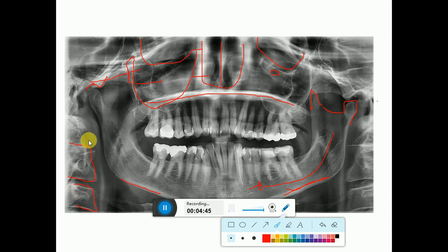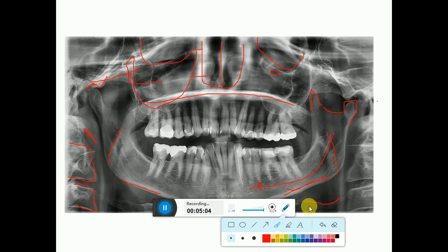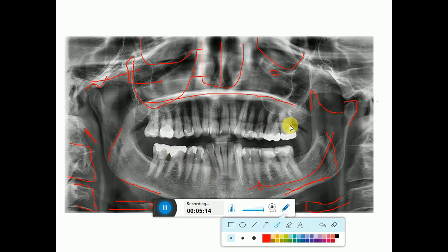This is the zygomatic arch on both sides. Here we can see the cervical vertebrae. This is the styloid process. This is the shadow of the tongue — it will be present on both sides. And this is the shadow of the hyoid bone, also present on both sides.